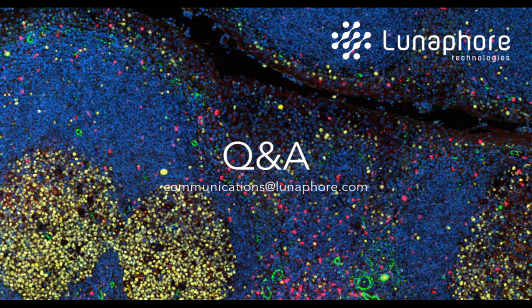Another question coming in. This one is saying, could you please give a rough estimation of the staining time per sample for a 20-plex panel? Yes, so we do have an average, but it's a little bit vague, so we'd rather give some examples. One of them I showed in the presentation: a 24 marker panel scanning 4 by 4 square millimeters takes 5 hours. And another example of a 30-plex took us 8 hours for a 9 by 9 square millimeter area.